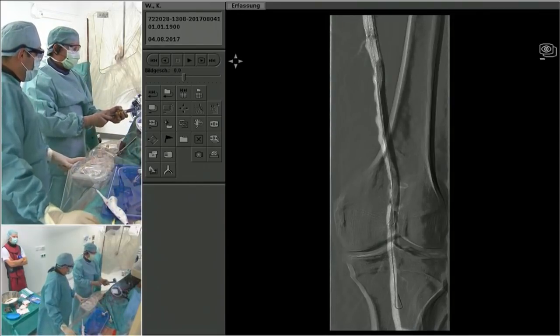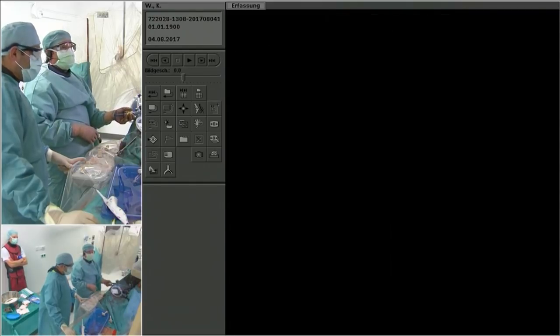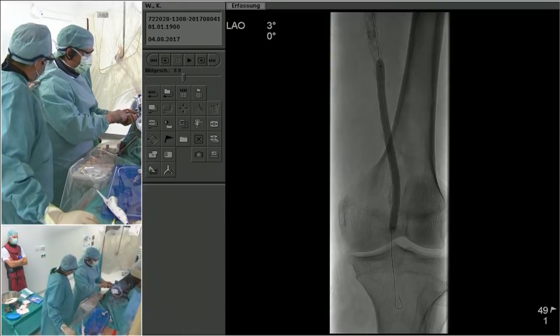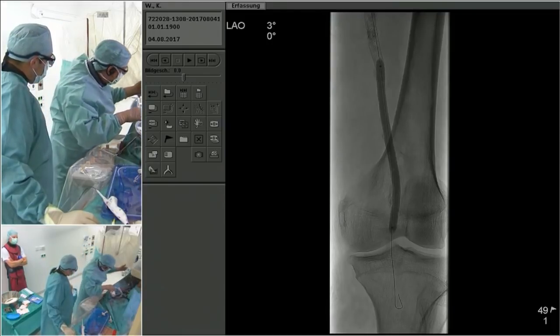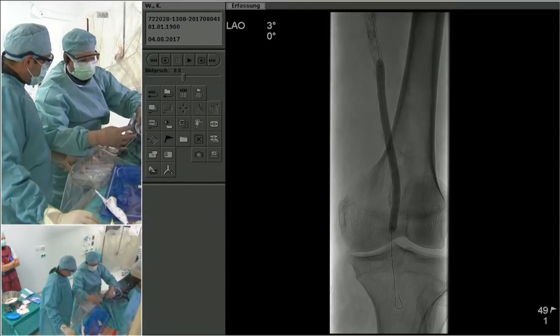Subhash, I think, is an example for the audience of how not to be scared of calcium, heavily calcified vessels, because these are very crossable, just using different techniques. Ehrin, the initial approach for this heavily calcified lesion in your hands is always a 035 guide wire and a support catheter. You go smaller.